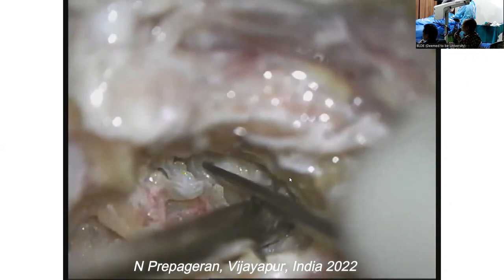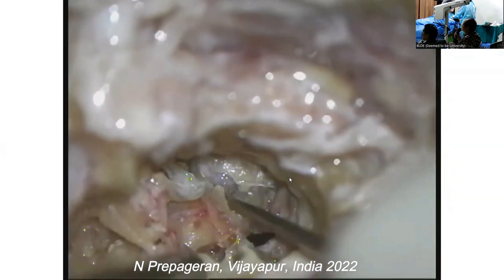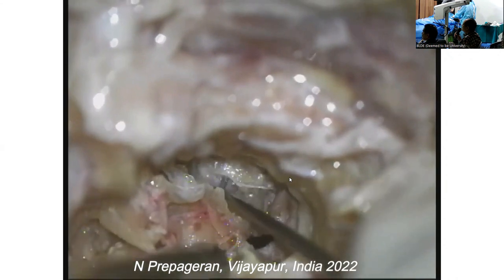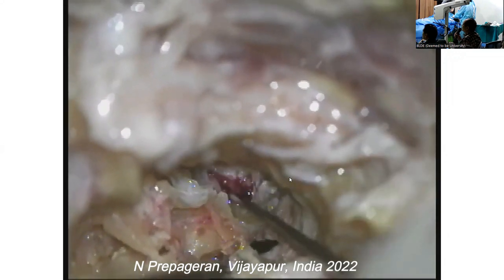What I wanted to show you is how difficult it is to injure the arteries. You see, I'm still not through. I'm only through the tunica adventitia. The tunica media is still intact. So I'm going to poke and then only I can open.